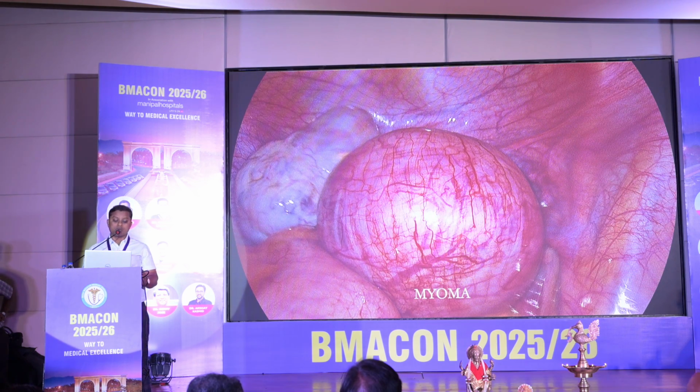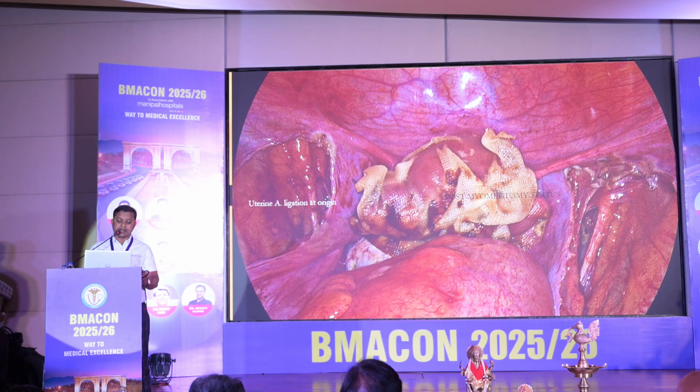This is the myoma that we removed, and this is the chocolate cyst, and the end result was something like this. Here also we did uterine artery ligation at origin. Blood loss was very minimal, quite minimal.